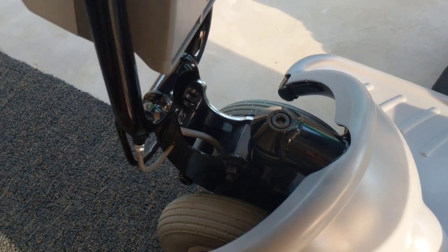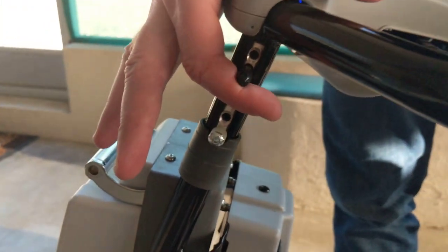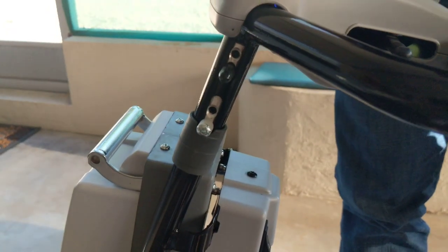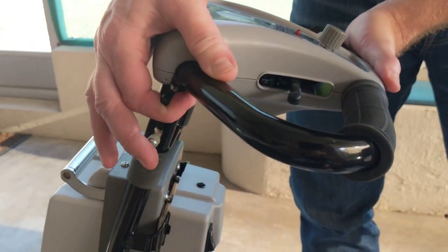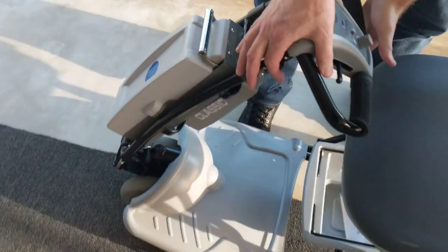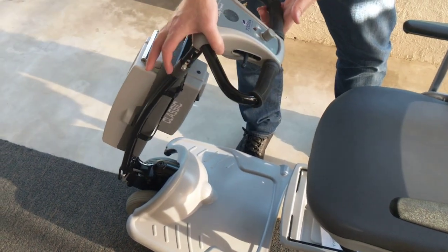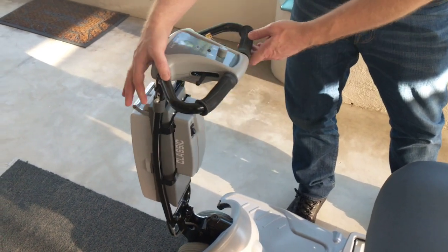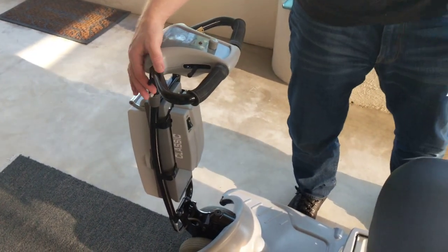The first thing we're going to do is lift up on the little notch on the left side of the steering column once the Lexus Light is turned off. That allows you to set the steering column in different positions that are most comfortable for you.